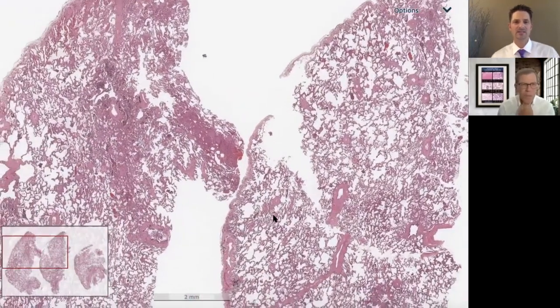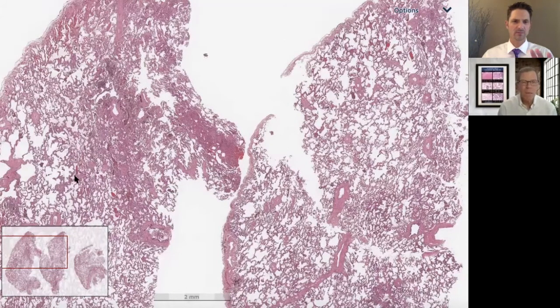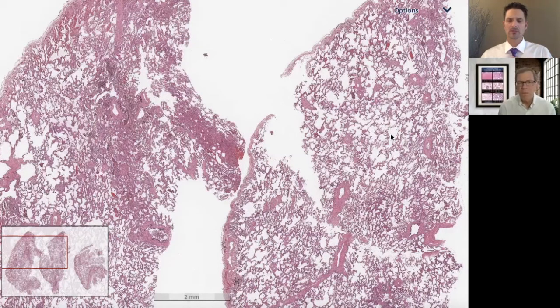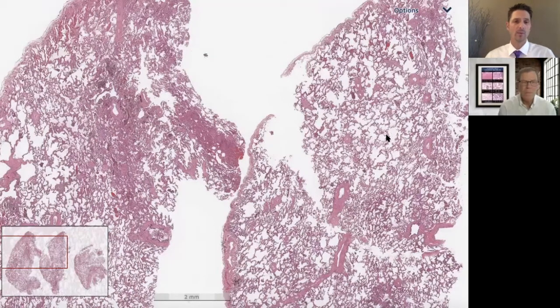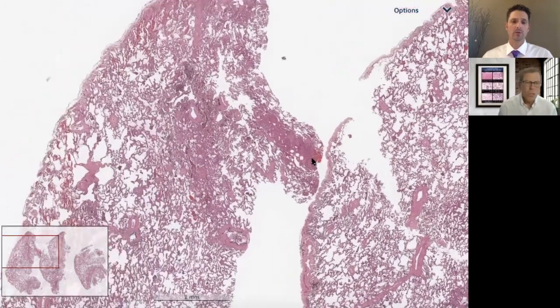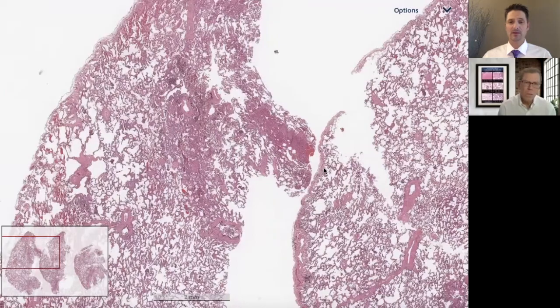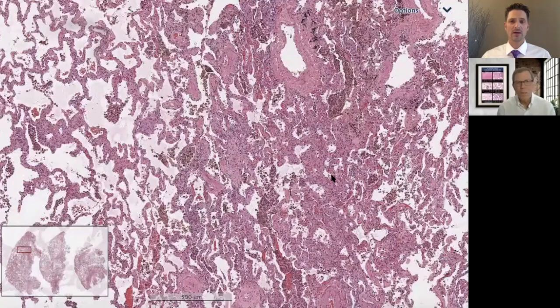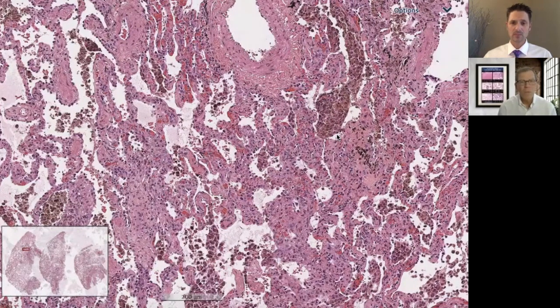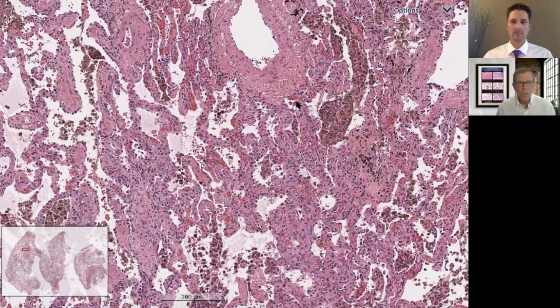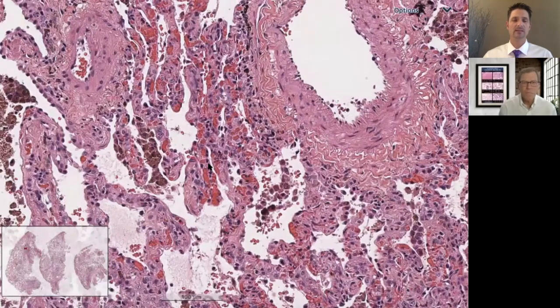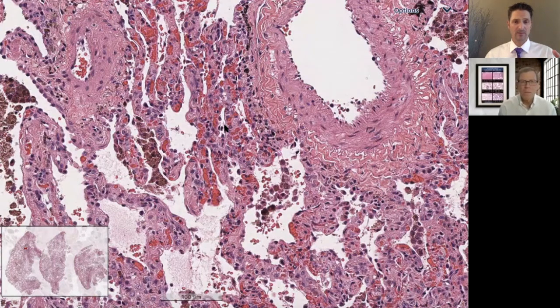If you look at this low-power field you can see there's much more interstitial expansion on the left than on the right, which would translate into the CT scan as areas of more increased opacity versus more normal-appearing opacity. So we've got this expansion of the interstitium by a capillary network that's patchy throughout the biopsy. A few other findings: we do have an extensive number of hemosiderin-laden macrophages, vascular congestion, and a beautiful red blood cell tracking along the alveolar walls — right there, very nice.